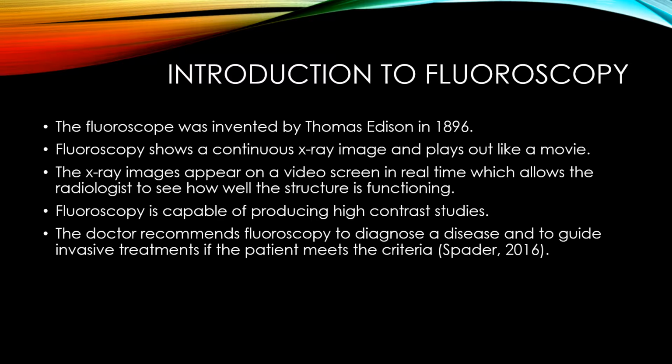After X-rays were discovered by Roentgen in 1895, the fluoroscope was invented by Thomas Edison in 1896, and his assistant was Clarence Daly. When radiologists first performed conventional fluoroscopy, they had to dark adapt their eyes for 20 to 30 minutes, where it was required to wear red goggles to see dim images.